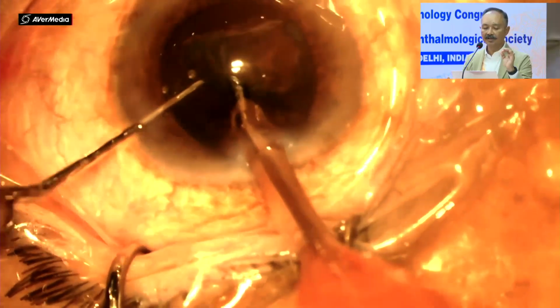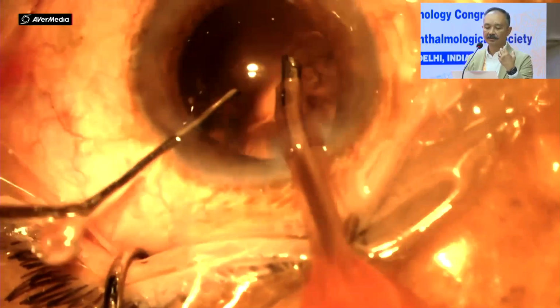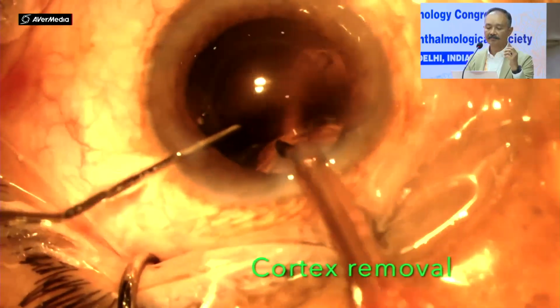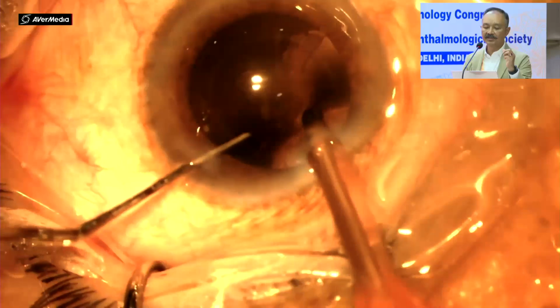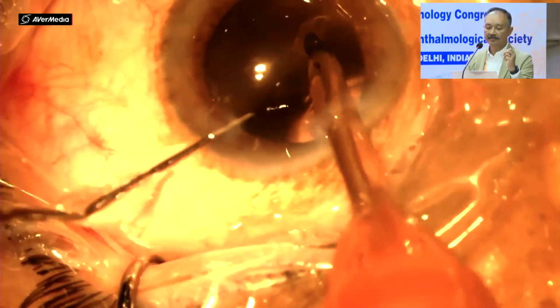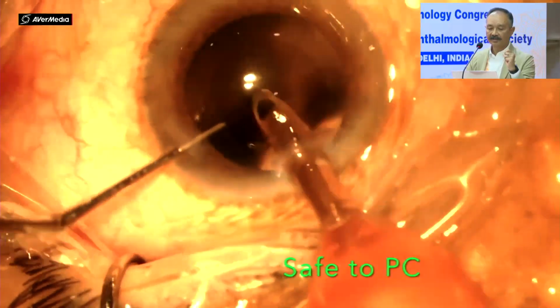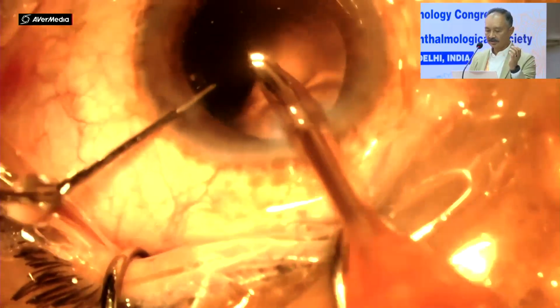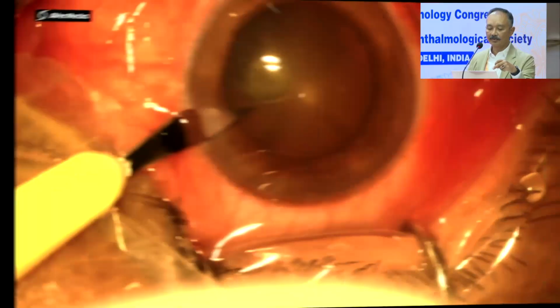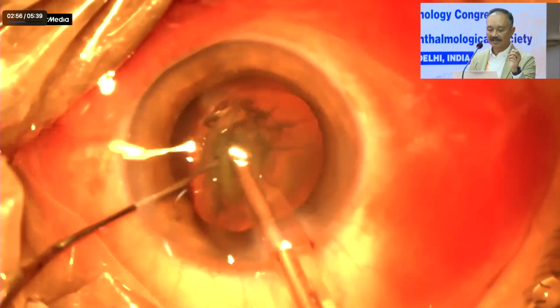Again, keep looking at the face or mouth of the phaco tip, which is most of the time facing the corneal surface, not towards the posterior capsule. Because of this orientation, it is something like the IA handpiece, and we can use it for removal of the cortical fibers also. So it can be called safe. So we can have a wide approach with this reverse Kelman phaco tip. This is the second case.